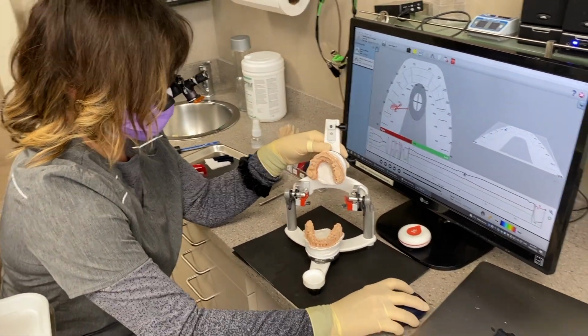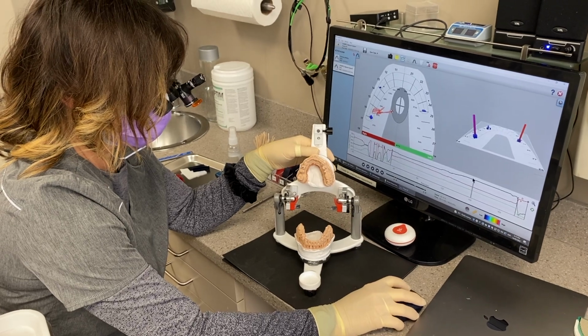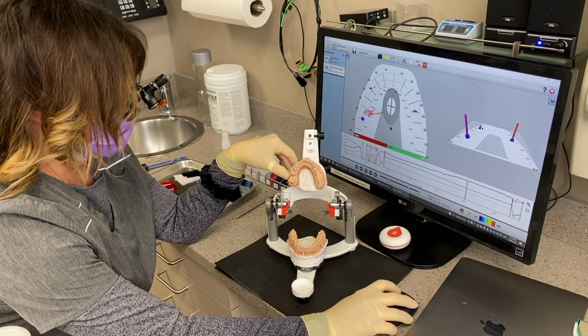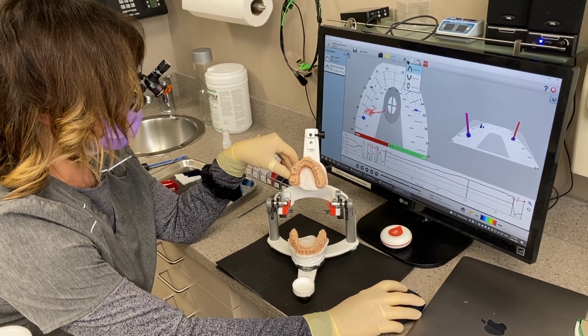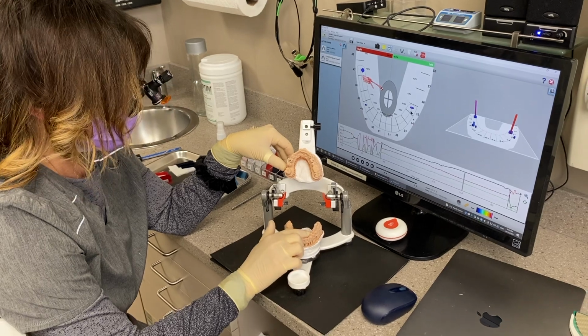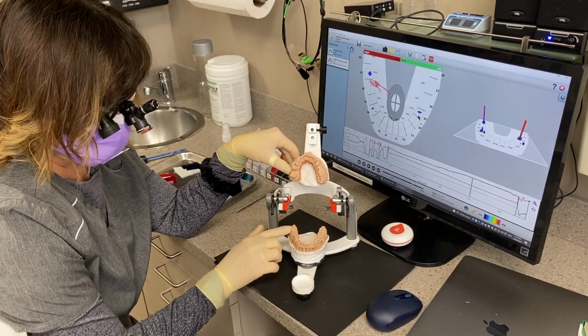And bring it back here. And now I've got a visual recording. And we're going to adjust. You can flip it out to show lowers. And we're going to adjust this area and this area.